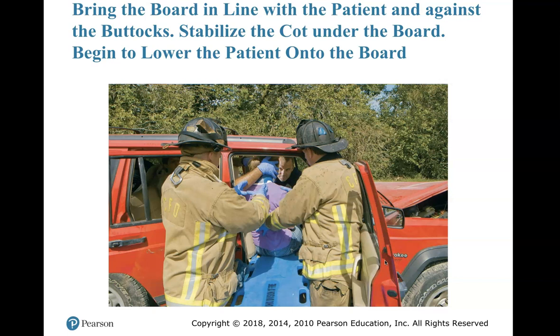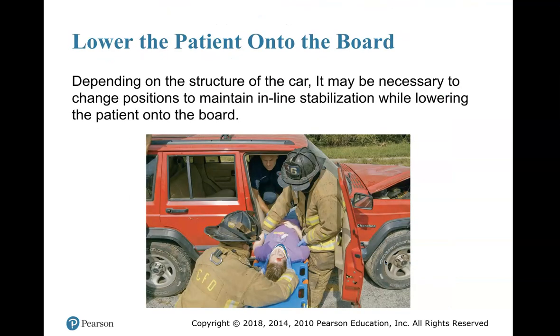Please do not try to put your long backboard right there under her butt between that seat and think it's going to elevate itself. You're probably going to need to already have it on the stretcher so that it can elevate. Or if you can't get the stretcher down there, have three or four people holding it up so it doesn't fall. Because once you put her on it, if something's not holding it up, it's going to hit the ground. Then you're going to have more injury. All right. Lower the patient onto the board.